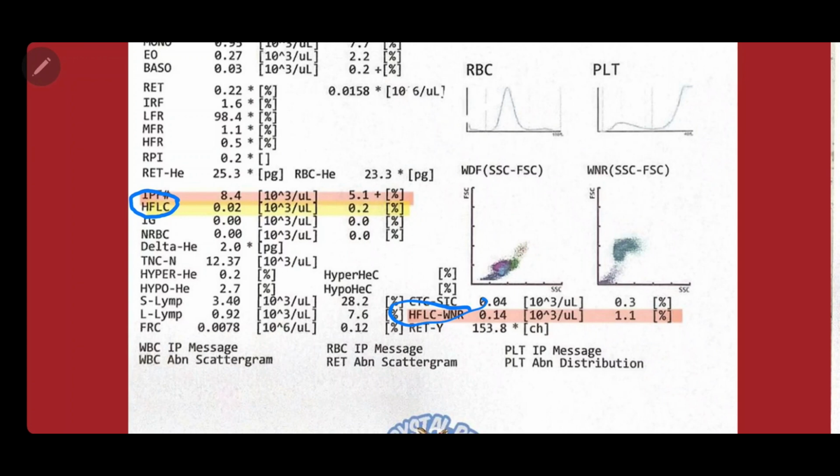IG stands for immature granulocytes. If IG is not present, it means the body can manage the current condition well. NRBC should not be found in healthy dogs. If a machine detects a lot of NRBCs, it indicates a malfunction, as it might be incorrectly counting lymphocytes as NRBCs.